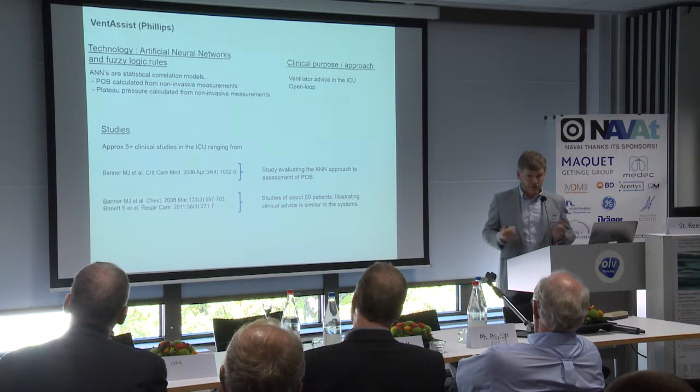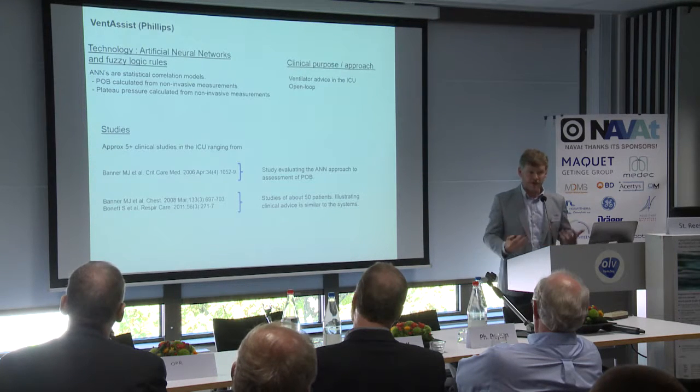So what they're doing is they've done several studies related to trying to say, can we predict the transpulmonary pressure, the patient's work of breathing, without the need for esophageal measurements? And then they've packaged these into black box models and included them into the system. And of course, if we don't need esophageal measurements for patients, then that's a very productive thing. And there's a huge amount of literature at the moment looking at the use of esophageal measurements in the intensive care.